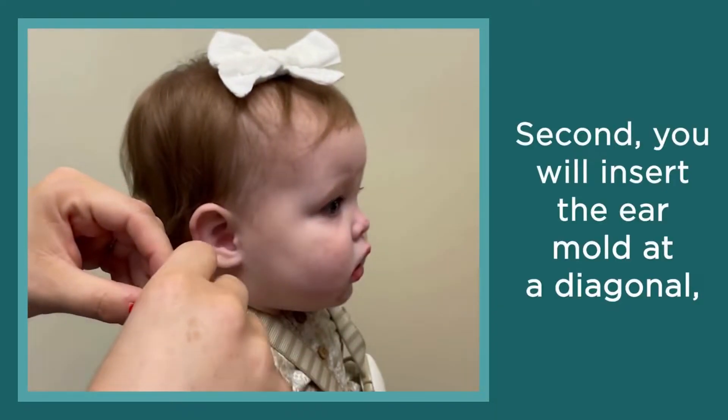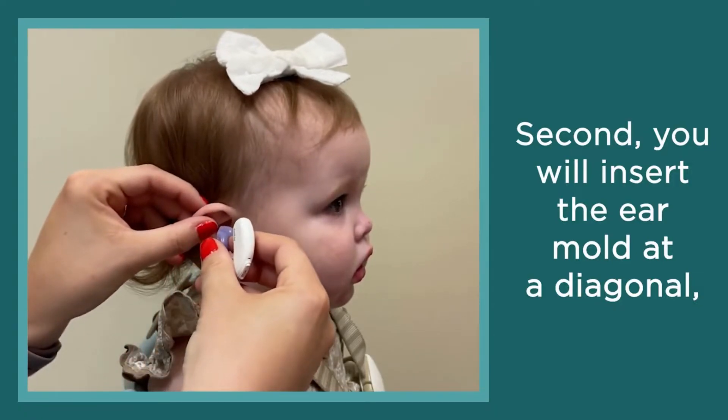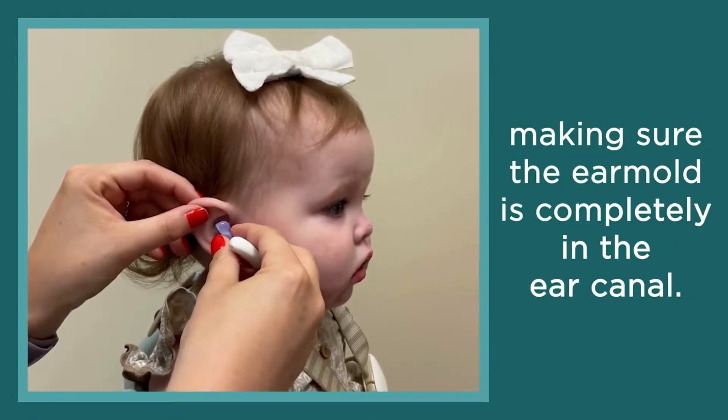Second, you will insert the ear mold at a diagonal, making sure the ear mold is completely in the ear canal.